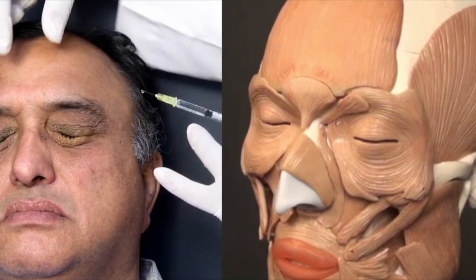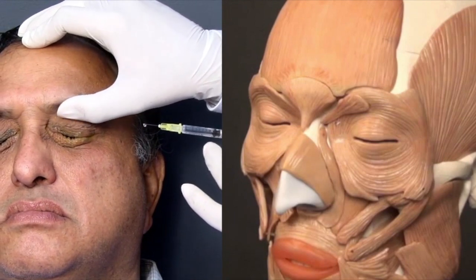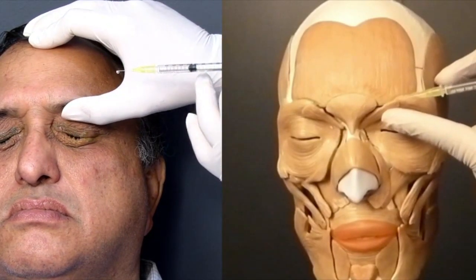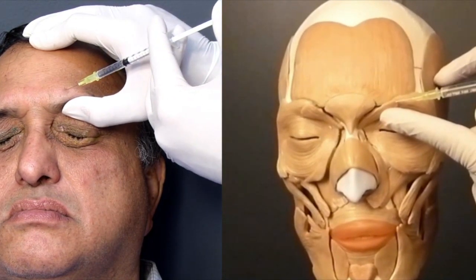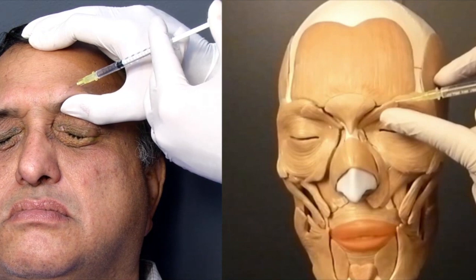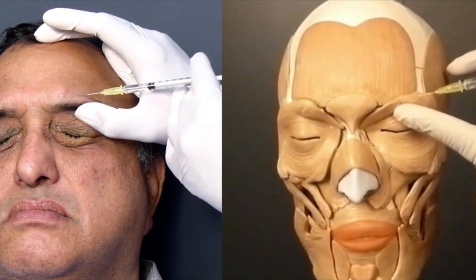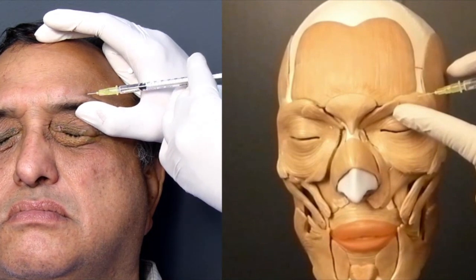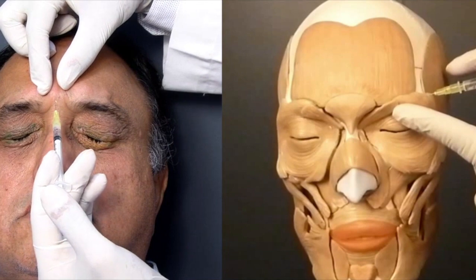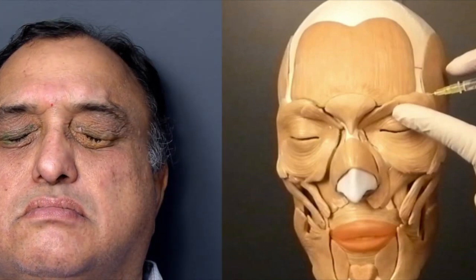The eyelid injections are now over. I would now inject the brow. For the brow, it is essential to keep your thumb on the superior orbital rim because many patients of this age would have brow ptosis and you don't want to inject too close to the orbital rim. I will go slightly deeper than the eyelid because the brow has a sub-brow fat pad. The two spots chosen are the junction of the medial and central third, and the junction of the central and lateral third, each receiving 0.1 ml. Finally, I do one in the center, which is the procerus. That completes the left side injection.